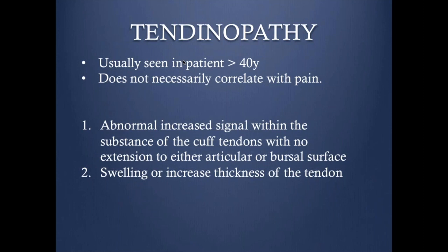How we are going to see it in the imaging: usually there is abnormal increased signal within the substance of the tendon with no extension to either the articular or bursal surface. Usually it has intermediate signal — it is not a fluid signal. Sometimes we see only swelling or increase in the thickness of the tendon, which is enough to call it tendinopathy. So either abnormal internal signal intensity or abnormal morphology or configuration of the tendon.